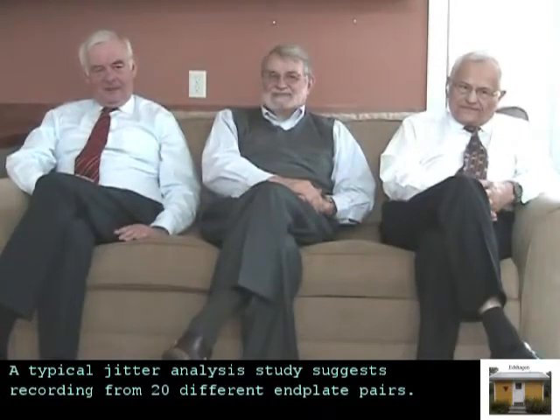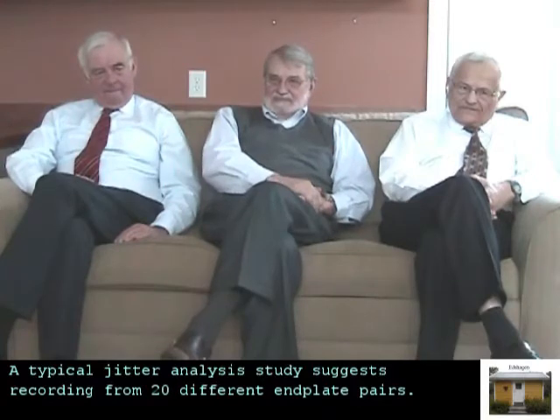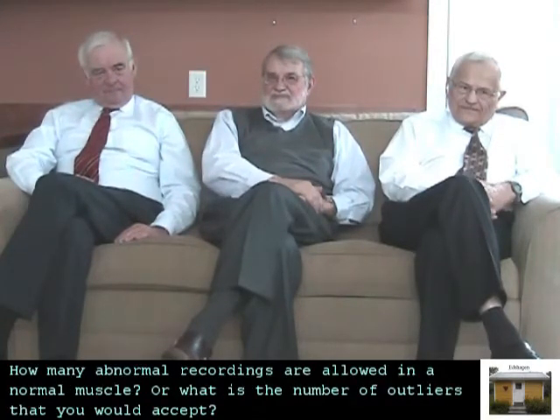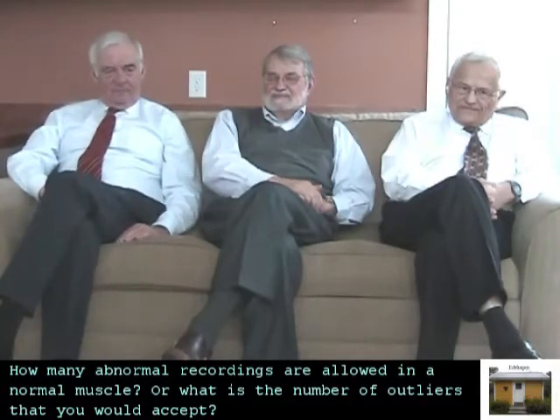A typical jitter analysis study suggests recording from 20 different end plate pairs. How many abnormal recordings are allowed in a normal muscle? Or what is the number of outliers that you would accept?